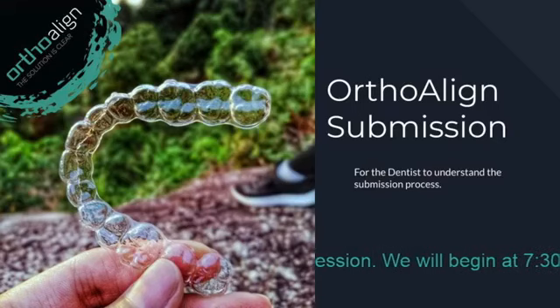If we don't get photos that are good enough, we may need you to retake the photos of the patient and have them resubmitted to us, because all this information and data is critical for our orthodontists in order for them to go ahead and do the planning of OrthoAlign for you.